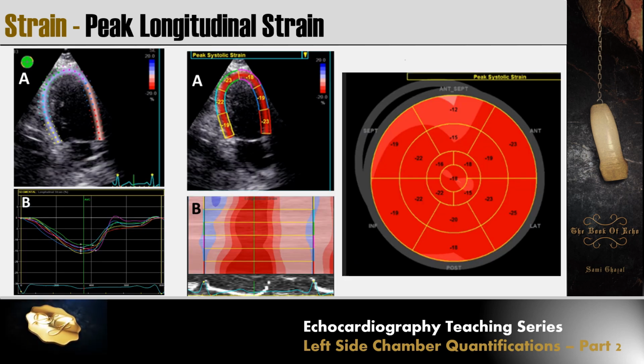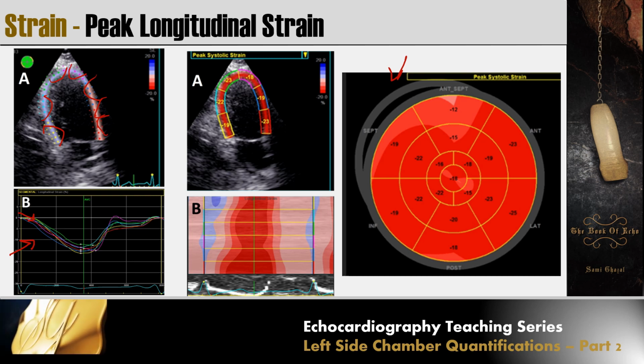Besides the bullseye here, we can present strain by waves like here. And as you can see, each color will represent a different segment. This is a different segment, and it's represented here by a wave or a line. And if you have all the lines going all the way down at the same time and then up all the way at the same time, it is considered synchronized. This is a way to measure dyssynchrony also in some of the diseases where you have one line going up, the other lines going down, like what we will see in left bundle branch block.